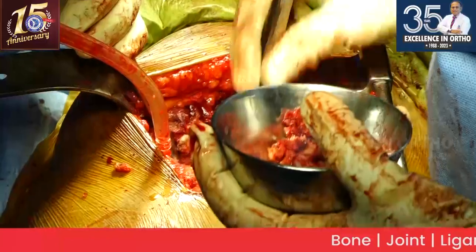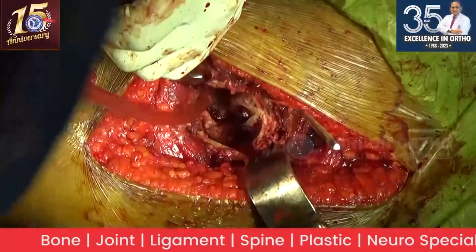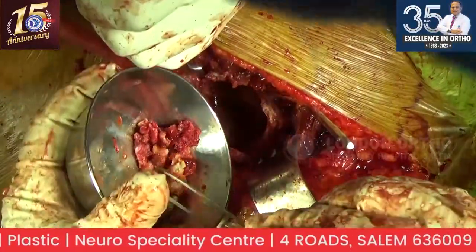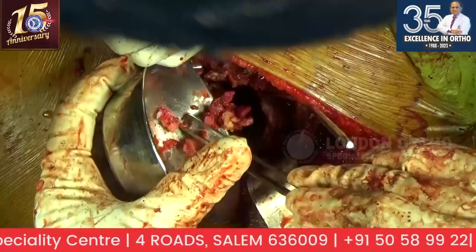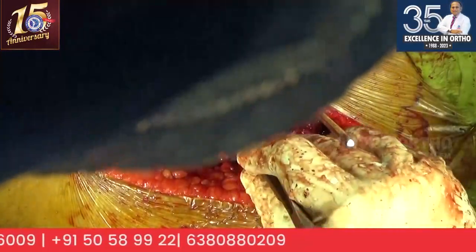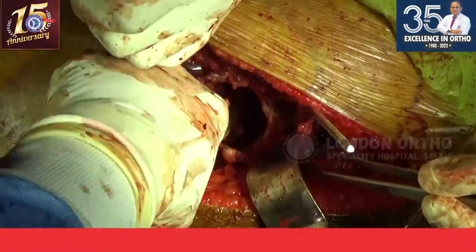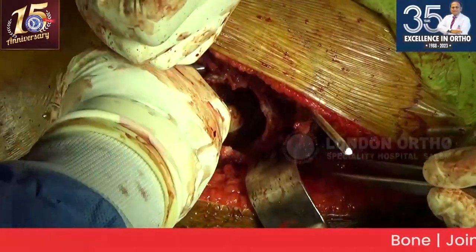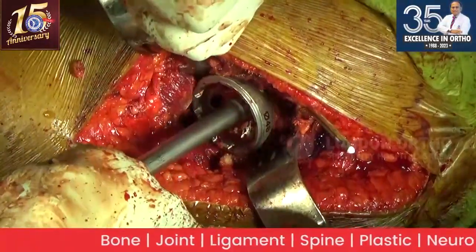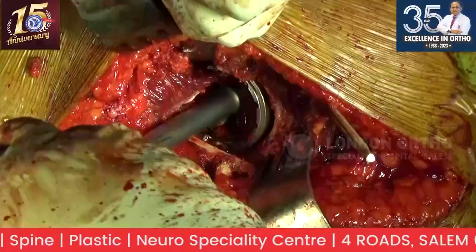Generally, after hemispherical cups have come, the reaming we used to do in the olden days, now it is one or less. I don't know about the design, I've never used this cup, so maybe fine. In this design, it looks like more. Sometimes I go same size. I check it and then decide. Trial kudupa. This is just to impact the bone graft. Yeah, hit it.